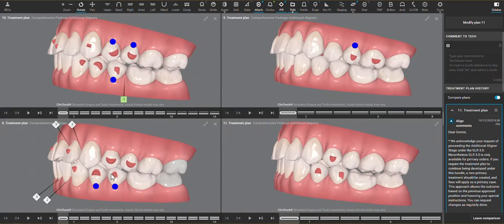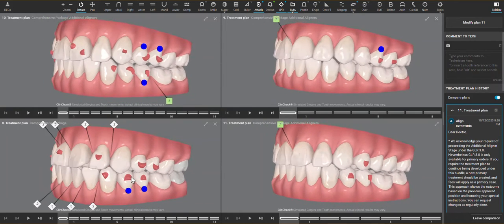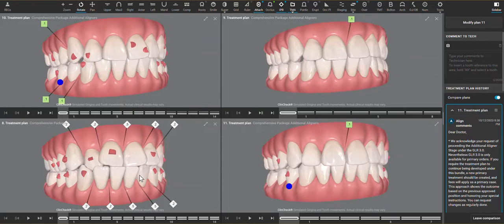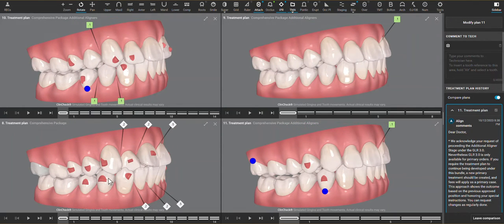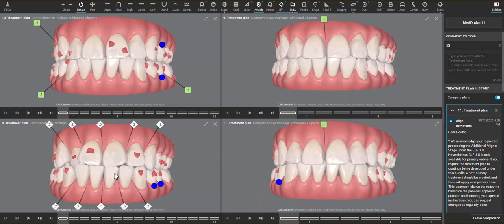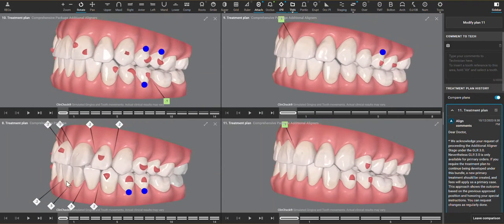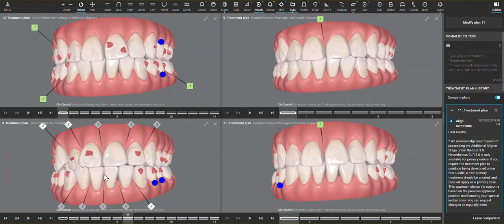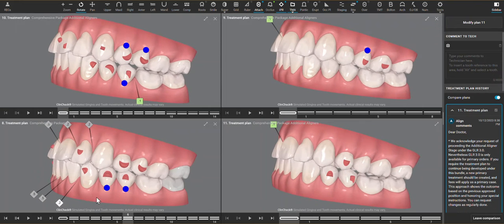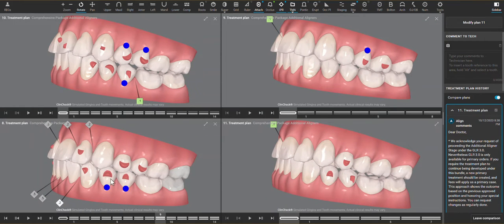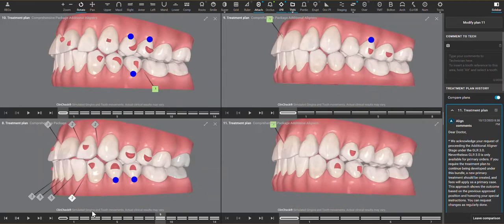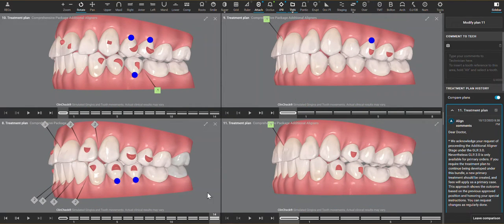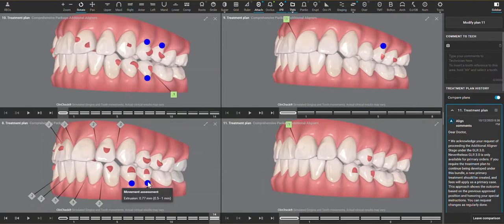Looking through here, I like that there were retention attachments. Clearly there is an anterior crossbite and some IPR planned, which I think is a good thing to increase the length of contacts here and protect these teeth from being pushed too far out of buccal bone. Overall I think a lot of this case went well.